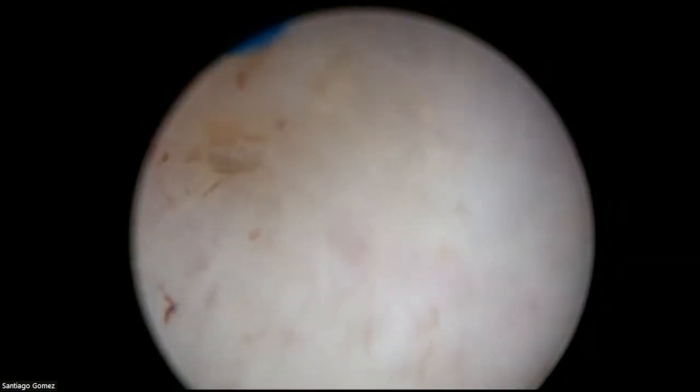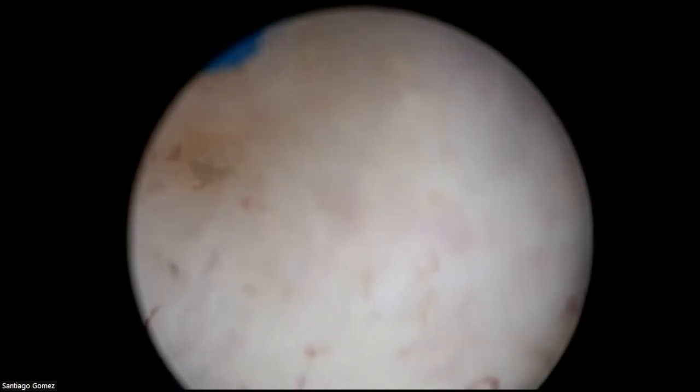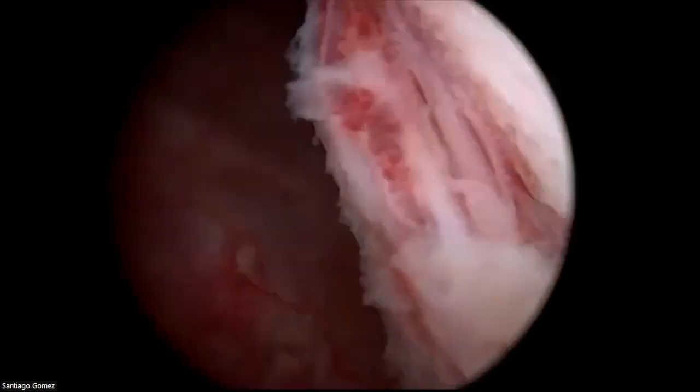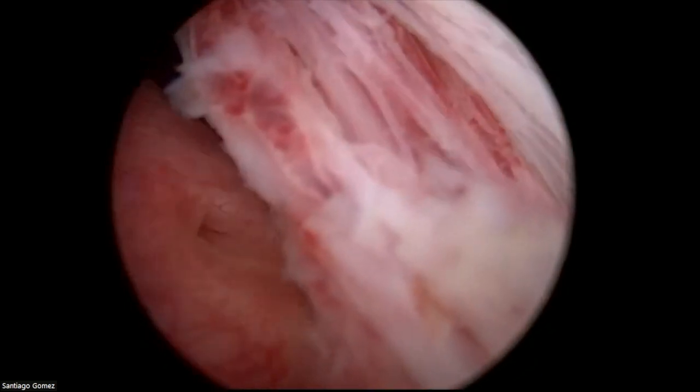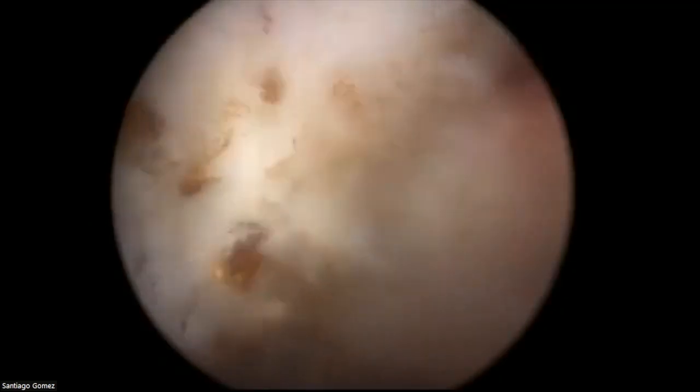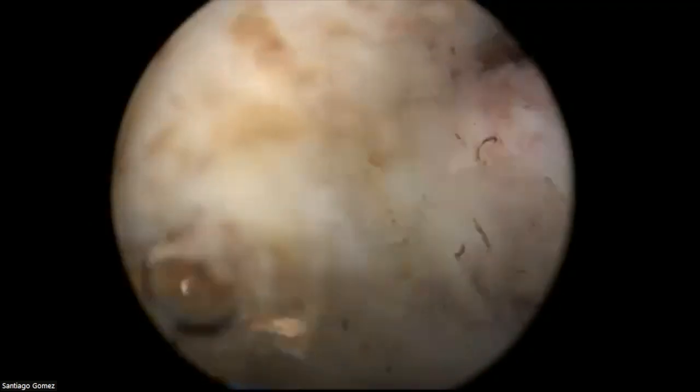Now I'm going to continue the rotation in the same sense. So I'm going to push very carefully, trying to tilt the prostate completely. And I think I managed already. And here's the last attachment, you see. Let's see where the UO is in this side. Here. So not so far, but I will try to complete the enucleation.